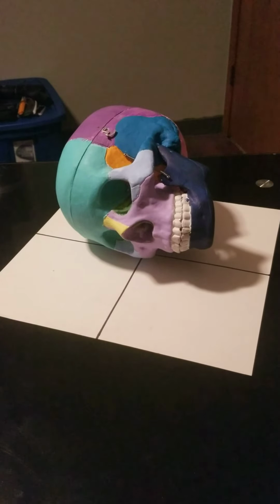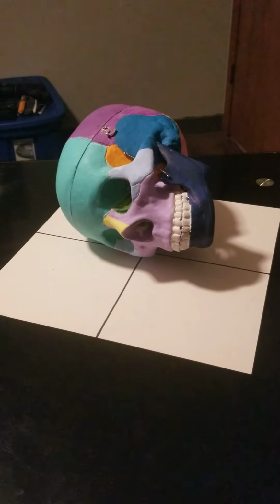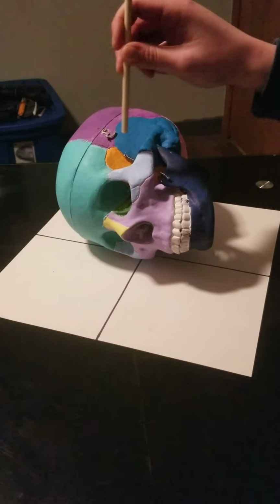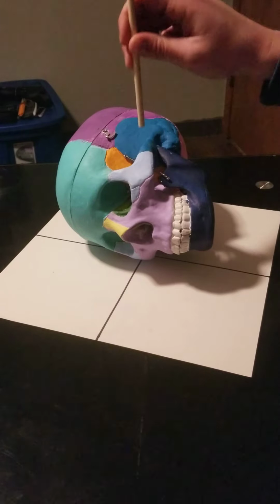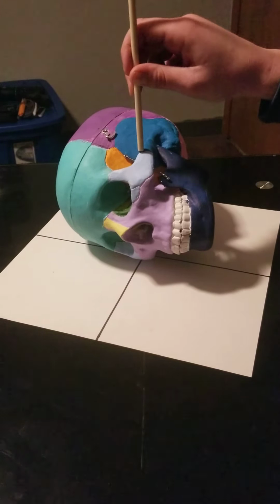And then I'd want to center to the zygomatic bone. I'd want my central ray to enter midway between the outer canthus on the zygomatic bone and the EAM, so roughly about right there.